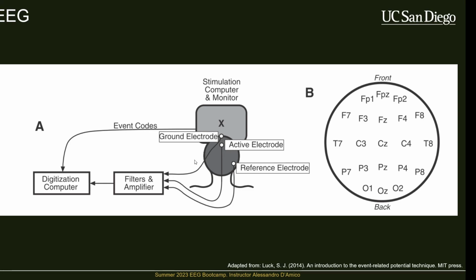But to answer the first question, EEG can be sampled arbitrarily high. The most common thing you see for most amplifiers is they're taking in an analog signal and digitizing it at 50 kilohertz. So this is 50,000 samples per second. This then gets downsampled typically to something much smaller, like 1,000 hertz or 500 hertz or 250 hertz, which is then actually what you're seeing on screen and what you're saving.